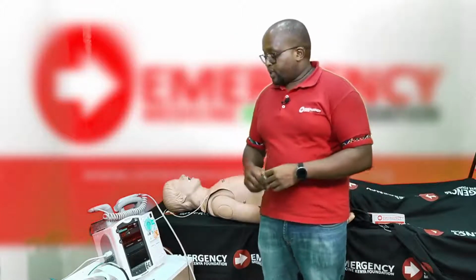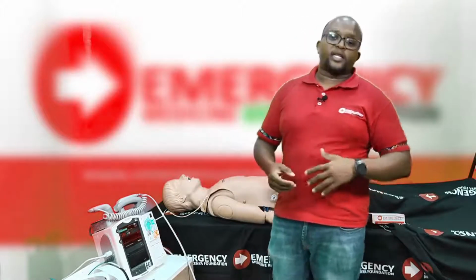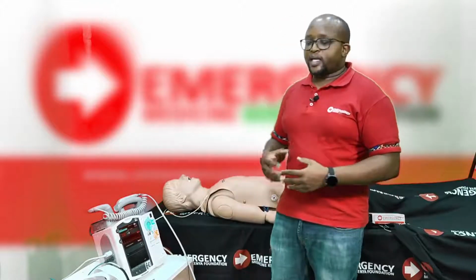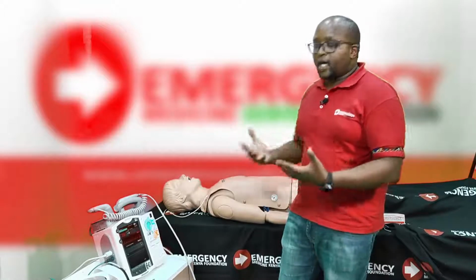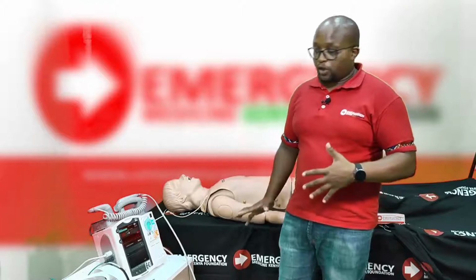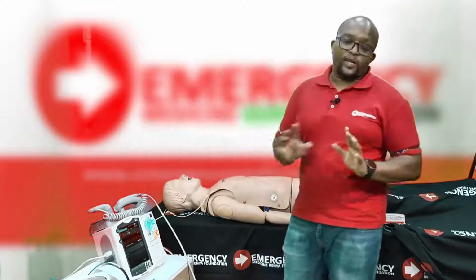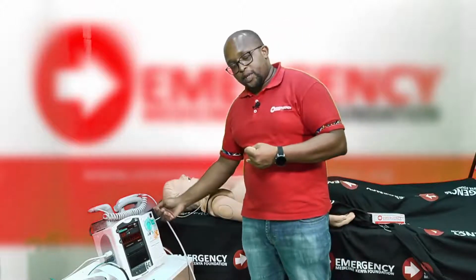The third reason that potentially it's not working is there is something underlying. And this is why, as I said, you need to consider things like hyperkalemia, toxins, or anything that is circulating within the patient's bloodstream that is triggering the heart. And that's one of the things that you may need to consider before you give a third shock, okay? So ideally, before you give a third shock, consider, is it my energy dose could be, so I need to go up on the energy.